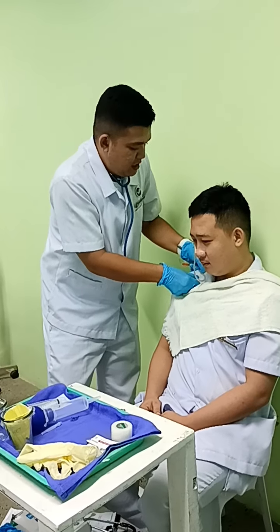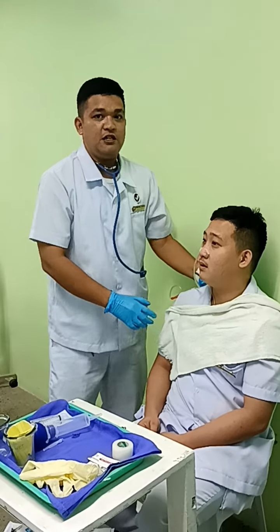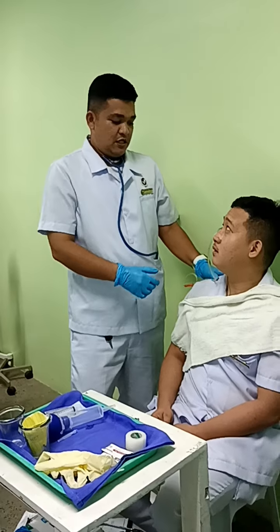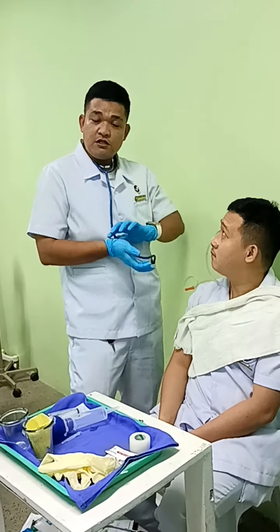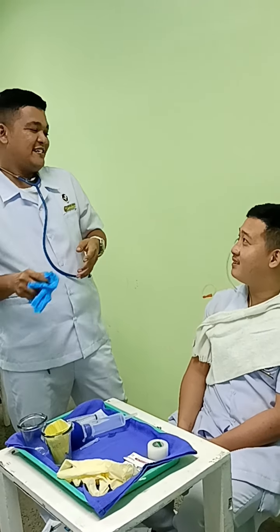Place it properly. Reposition the patient and maintain the position for 30 minutes to 1 hour. And last but not the least is to document results, take off your gloves and wash hands. Thank you.